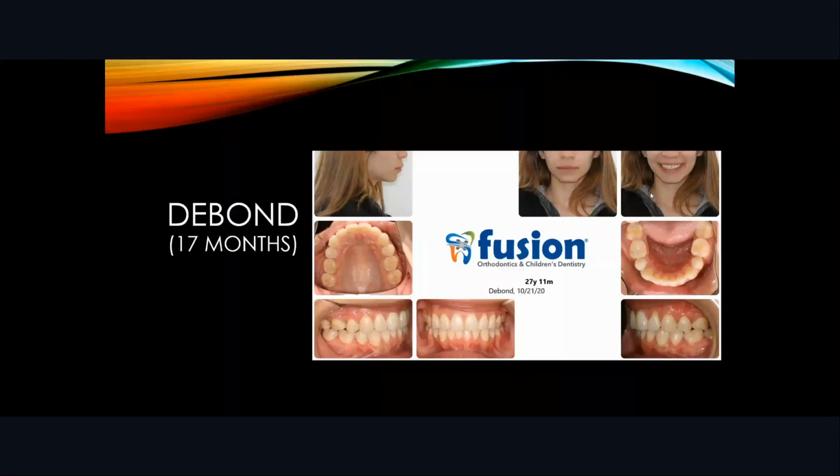When it comes to the end of the treatment, there are three scenarios possible. One scenario is that everything looks perfect. So all you do is scan for your final retainers. The second scenario is that everything is perfect, but that one tooth, that little space.